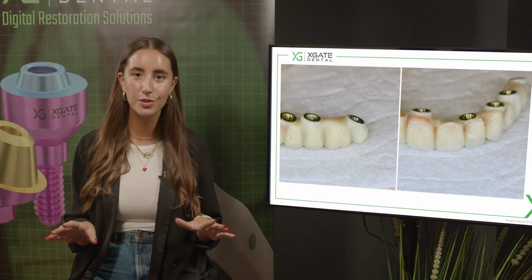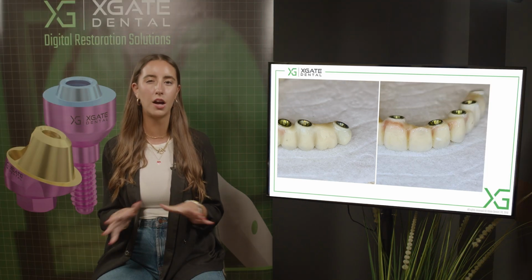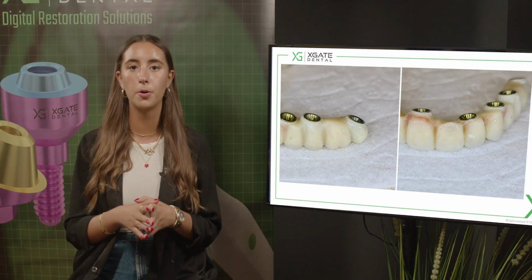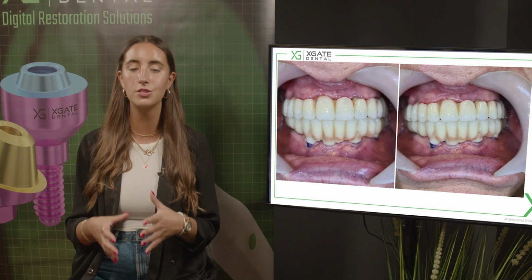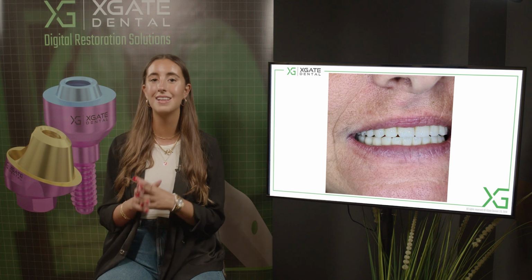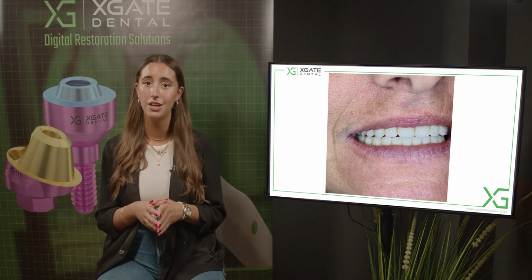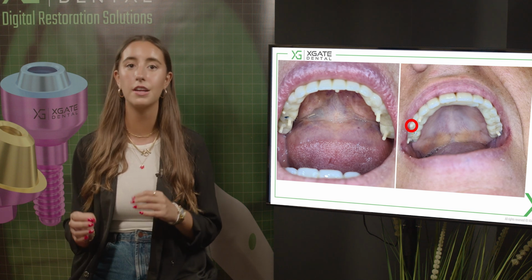Closed all the gaps with composite material. So when you're making a full zirconia bridge, the parts that close with the gingiva, it's better not to glaze, because this way you minimize the retention of the plaque. The part that closes the gingiva for the upper bridge is the top part. You can see here the final bridges, the screw channels in the first molar. This screw channel later on will close, and we'll apply a little bit of composite material to correct the color of the screw channel.